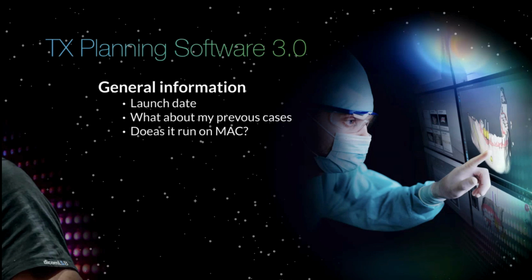Does it run on Mac? Simple answer, yes. It runs in a browser, so it's even better. It basically runs on everything. What we suggest is to download Google Chrome. It's optimized for Google Chrome, but it also runs on Microsoft Edge or Safari browsers.